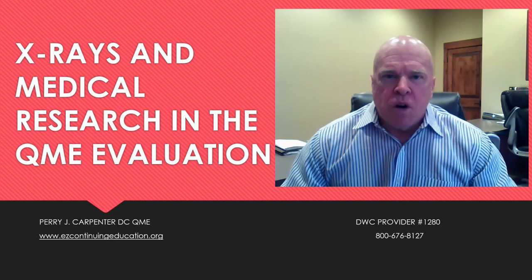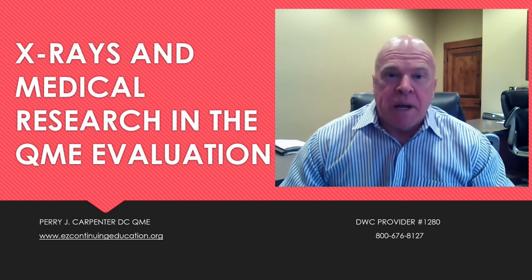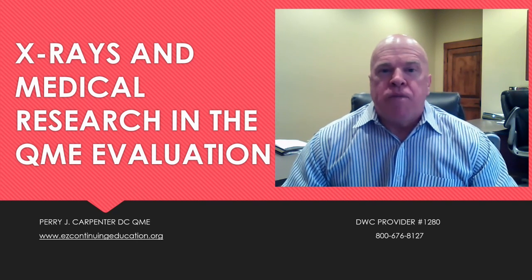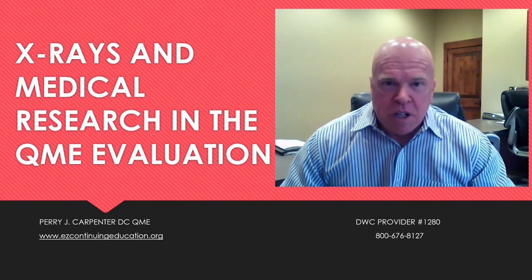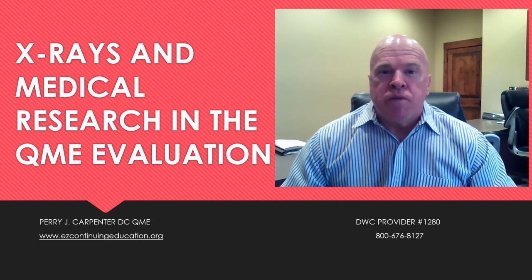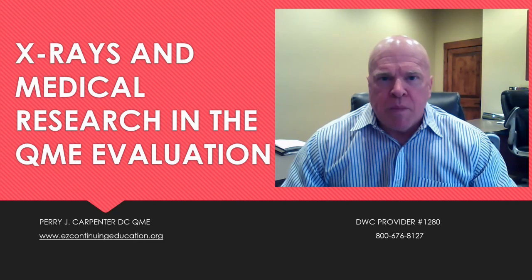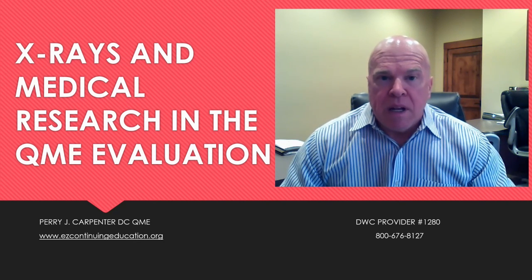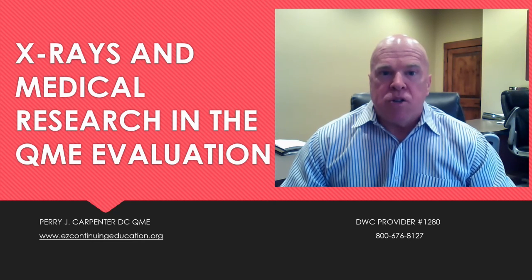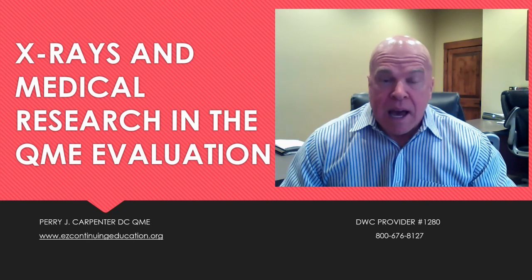On today's video, we're continuing with our new series entitled X-rays and Medical Research in the Qualified Medical Evaluation. And today we're in session number 3. So just to review what we've covered so far, in session 1 we talked about the uses of X-rays in the permanent impairment evaluation as described in chapters 15, 16, and 17 of the AMA guides.